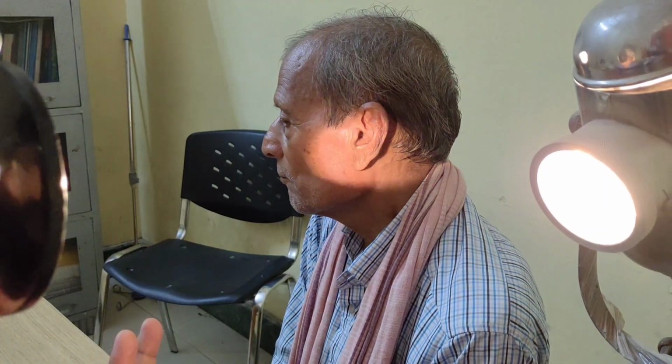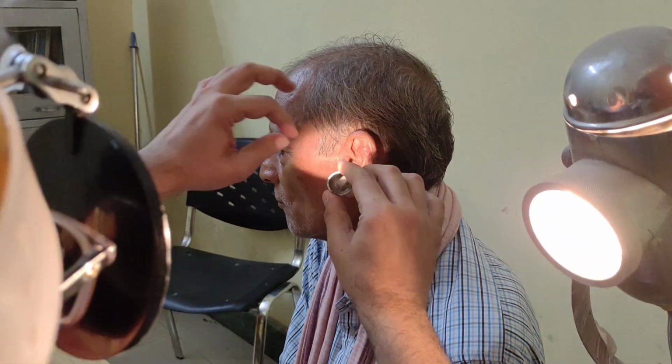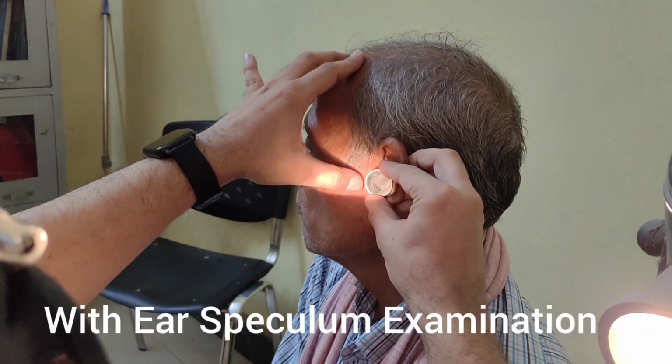Okay, once you have done the examination without the speculum, then we go ahead with the appropriate sized speculum for evaluating the inner aspect, the osseous part of the external auditory canal, right?